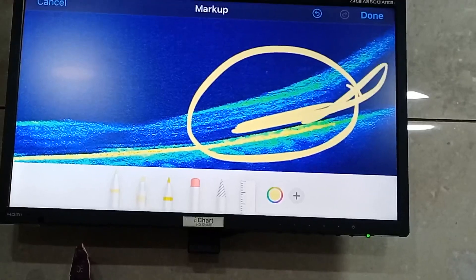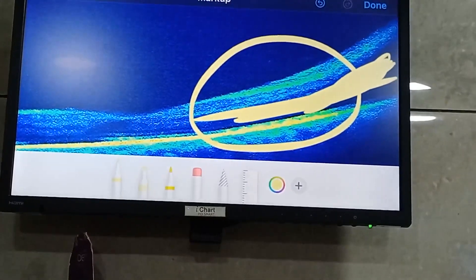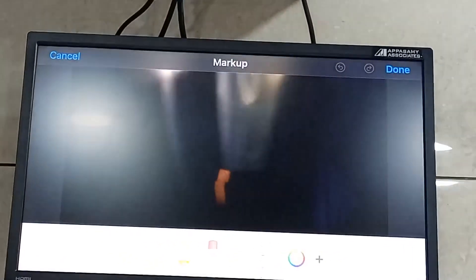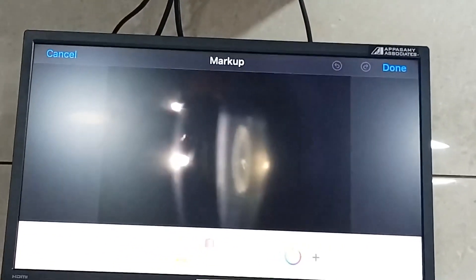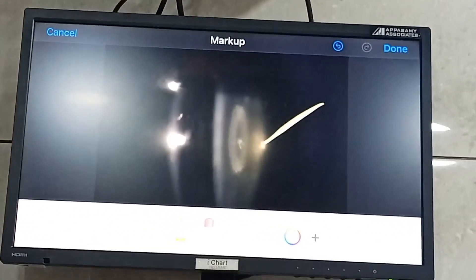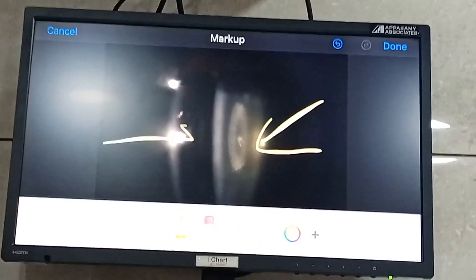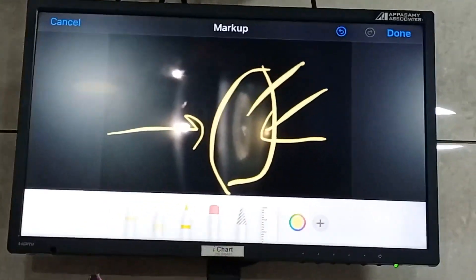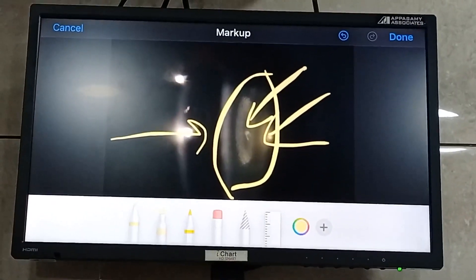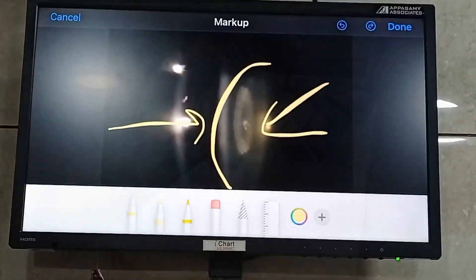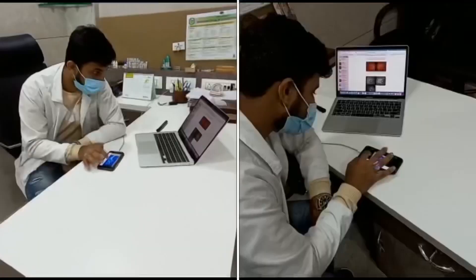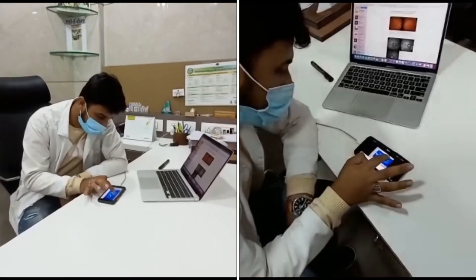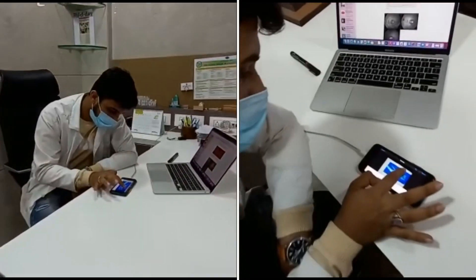Not just OCTs — you can even explain anterior segment findings, the most common being the cataract. And all the controls are in your hand, in your mobile, wirelessly connected.